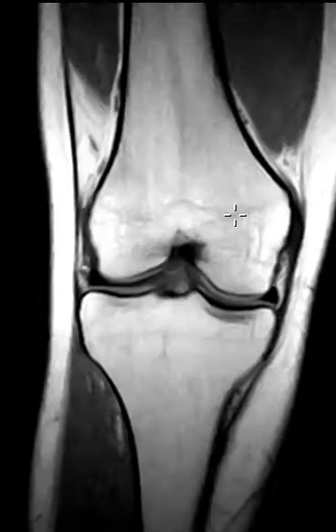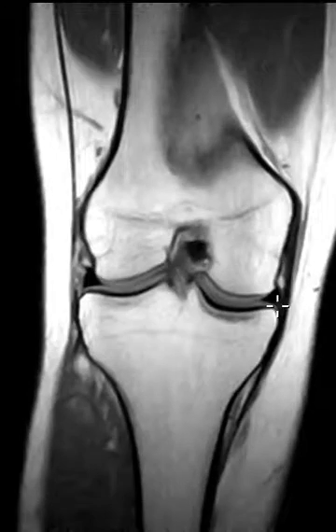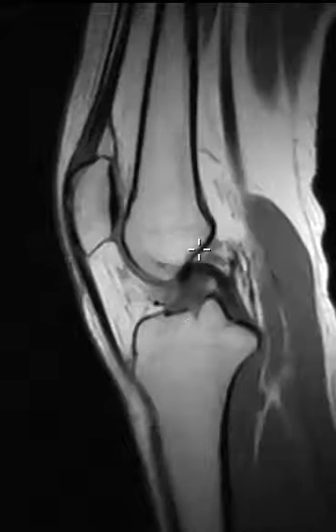There's no arthritis; they're very young. The menisci — medial meniscus and lateral menisci — look great. All the ligaments: ACL, PCL, medial collateral ligament, looking great. Lateral collateral ligament complex looking great. So things look very good so far.